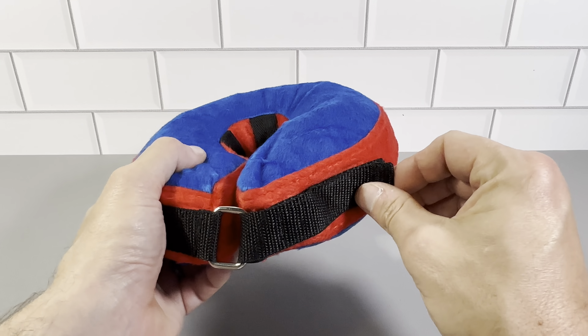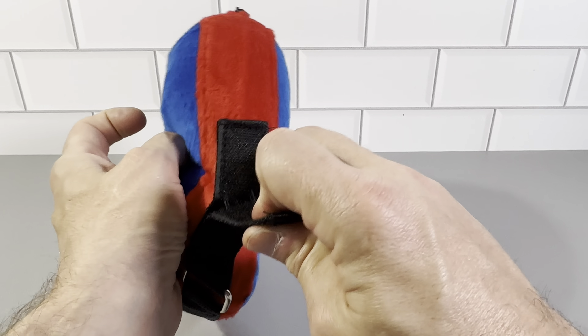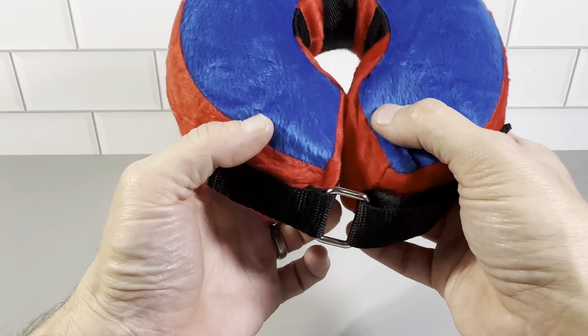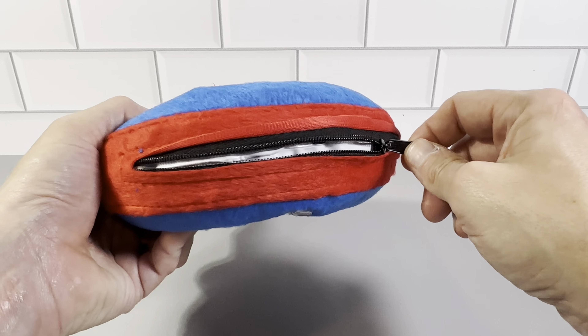Basically how this works, you're just going to open this area right here, which is nicely velcroed and stays put. You're going to open it and put it around the dog's neck, then close it up nicely and it just stays put and works really well.